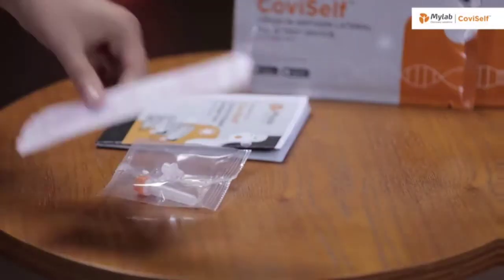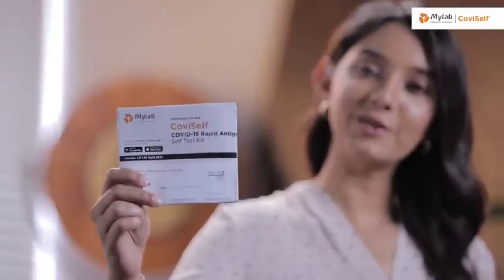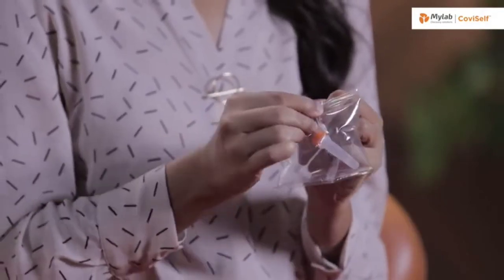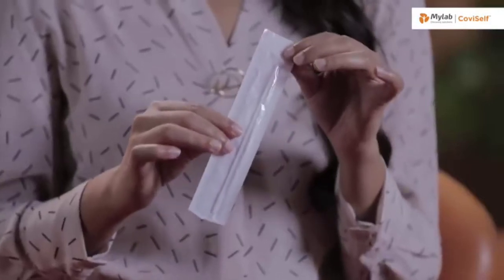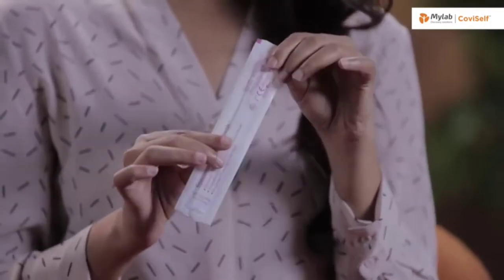Now let's tear the pouch and see the contents of the kit. Lay the contents of the kit on a table and I will walk you through them one by one. This is the instruction manual. This is a pre-filled extraction tube. This is a sterile nasal swab. As you can see, it has two sides — one is the plastic side and the other one is the paper side.